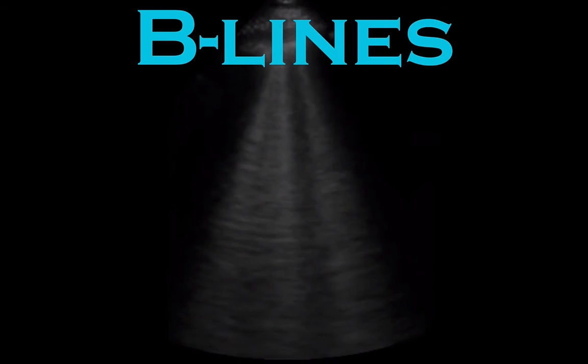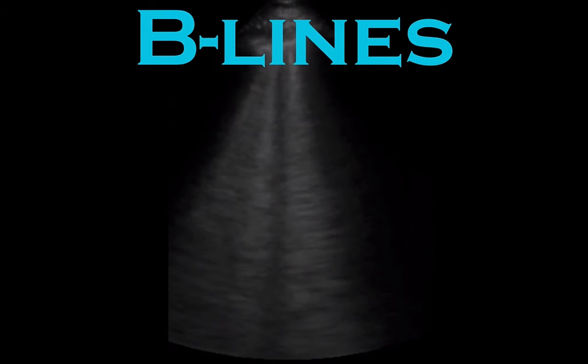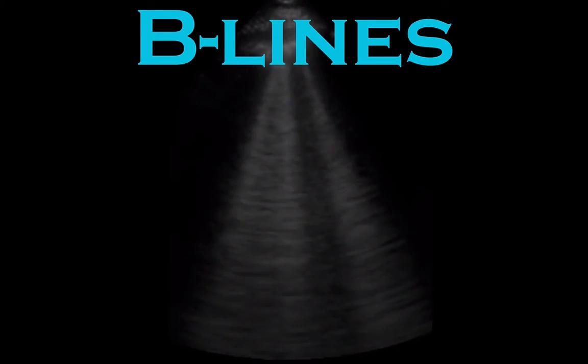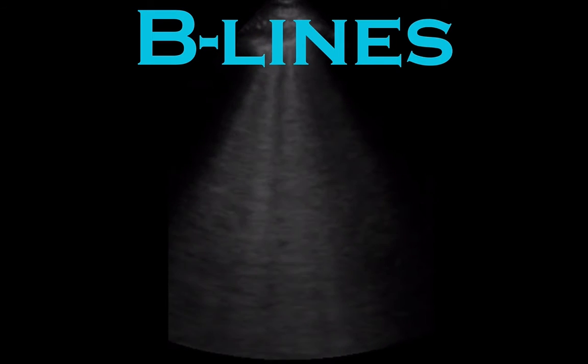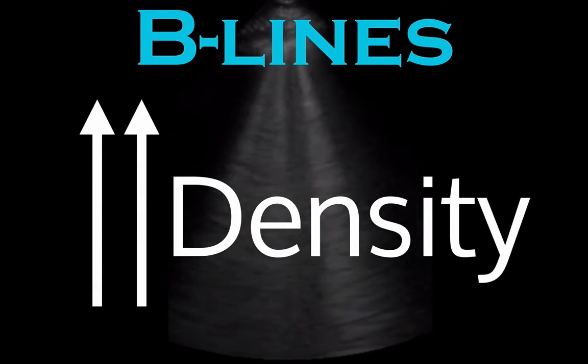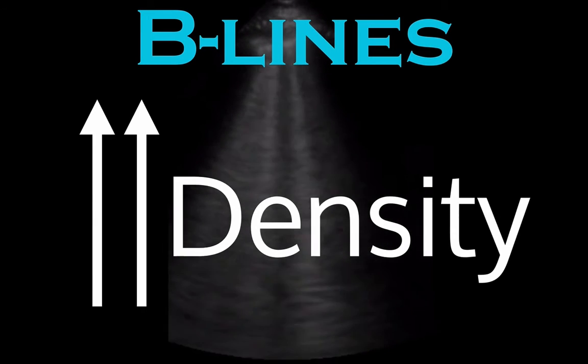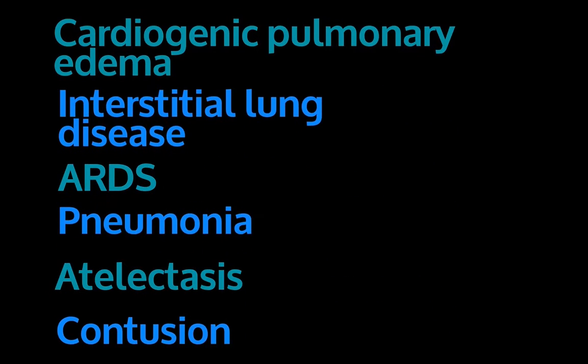Now, Matt, I kind of a little bit lied to you. What did you lie about? Well, you know how earlier you said you wanted it as simple as possible, and then I said it just means fluid? Yeah. Well, that's not actually true. What B-lines really mean is that there's increased density. I know that's one step above and maybe a little bit hard, but anytime that you might have increased density in the lung, you're going to have B-lines.